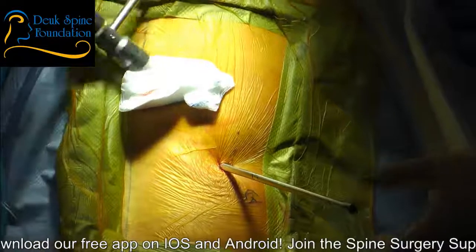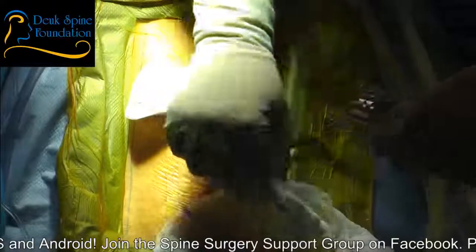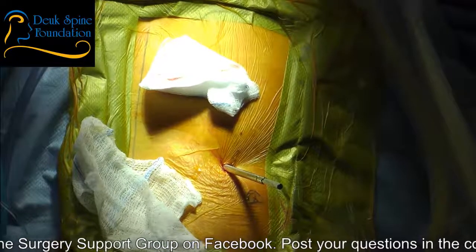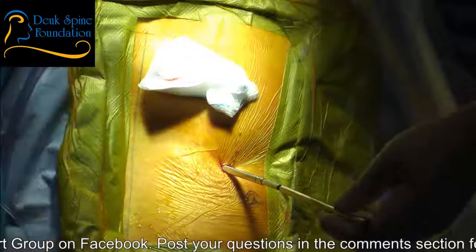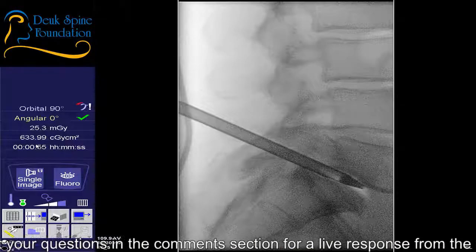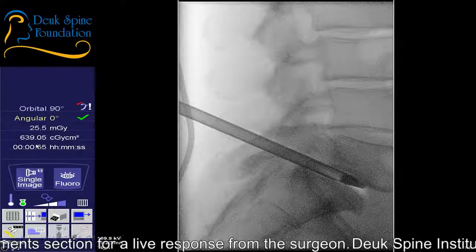All right, you can see the dilator starting to move forward a little bit. So we need to pull this dilator back because it's trapped. There's probably some tissue. Thank you, Luis, but I think we can do without it. I don't want to pull it back too far. What you don't want to do is advance the dilator into the pelvis, past the front of the disc. And if you're not watching carefully, you'll do that accidentally. So what I'm doing is advancing the tube and the dilator together. Not ideal, but I can't do anything about it because there's some tissue stuck between the end of the tubular retractor and the tip of the dilator.